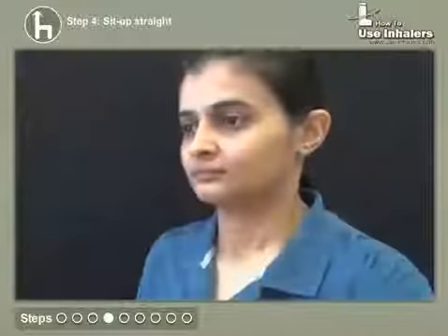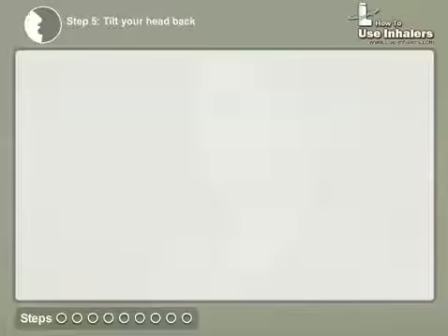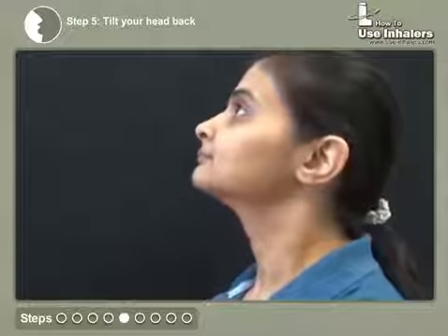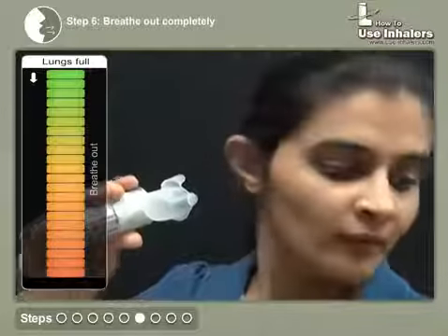Sit up straight or stand up. Tilt your head back slightly. Breathe out completely, away from the inhaler.